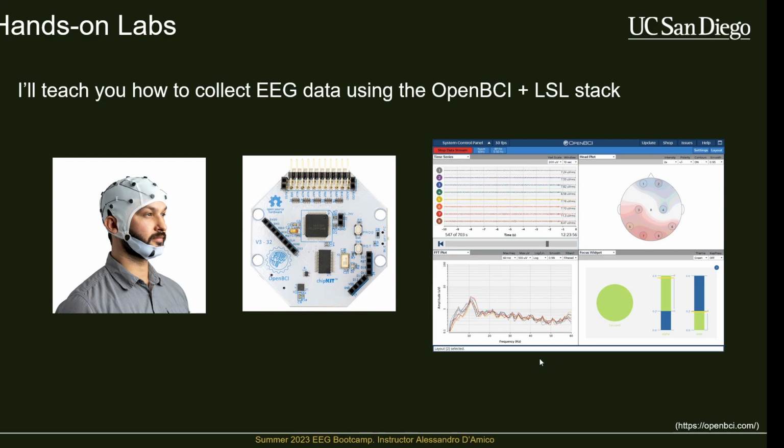On the right here is their software, which is the OpenBCI GUI. In the top left quadrant, this allows you to visualize the EEG signals coming in real time. You can also change widgets to see the average power across different regions of the scalp. You can just look at the raw spectrogram here, and you can do all sorts of things.